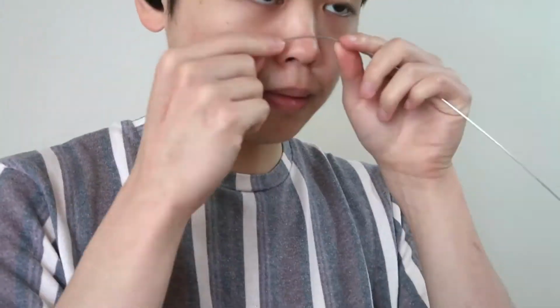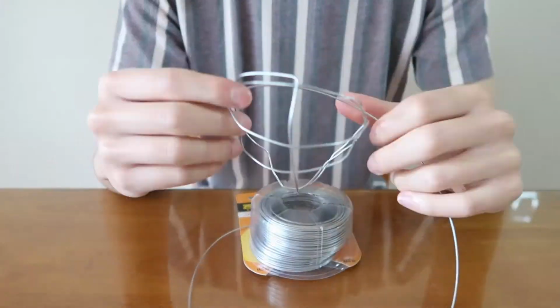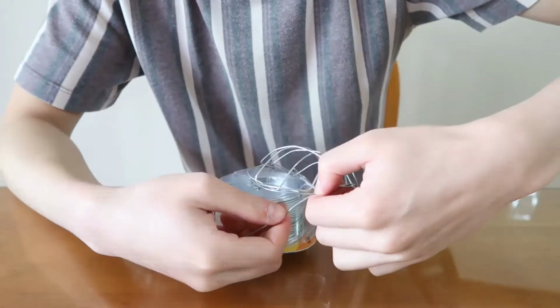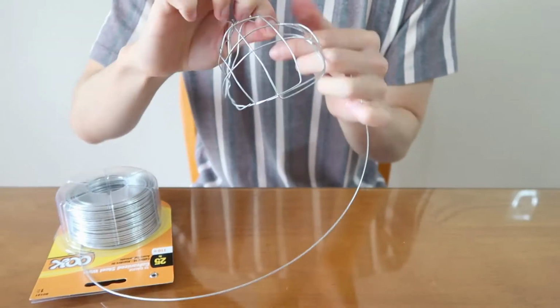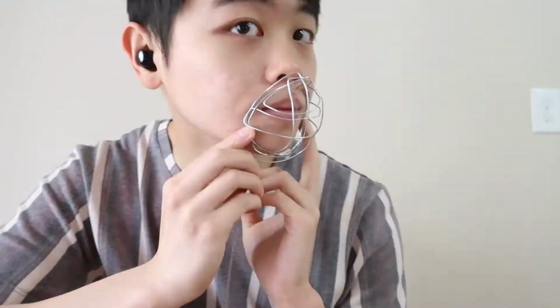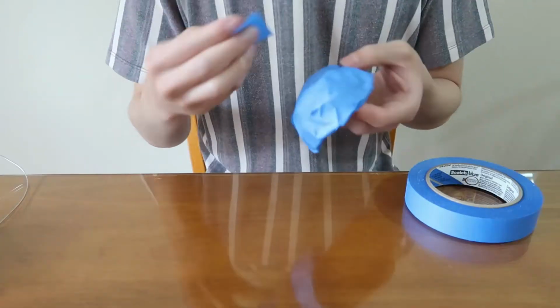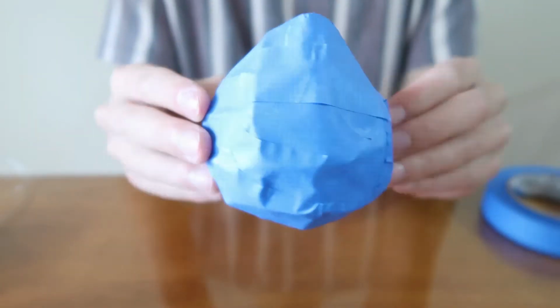Next, I need to make the mold. To make the mold, I'm going to use a metal wire and bend into shape. Making the mold with a metal wire turns out to be a difficult process because the wire has a spring back and it is also challenging to keep everything in place while bending the wire. I also cover the wire with masking tape so that the mask bracket can have a smoother surface.